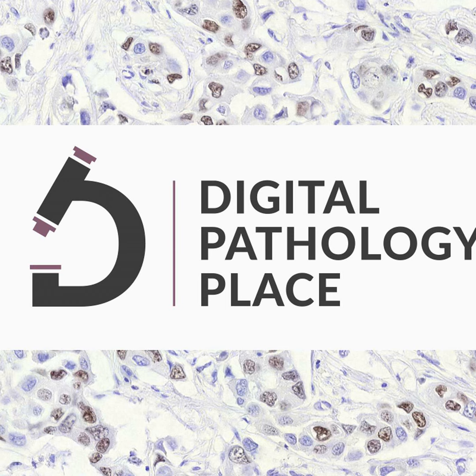So you basically feed the whole image if it's just a natural image. You tend to just feed the entire image. And as everybody in computational pathology knows, for a slide, that's not so easy. A typical slide consists of more than 10 billion pixels.